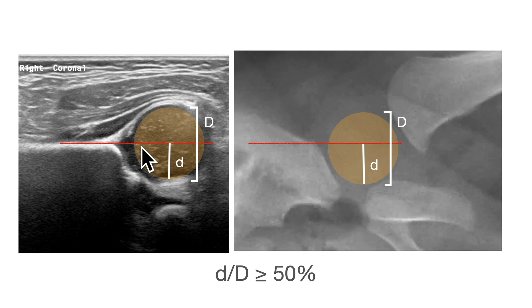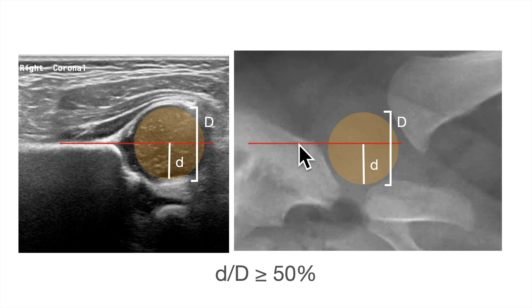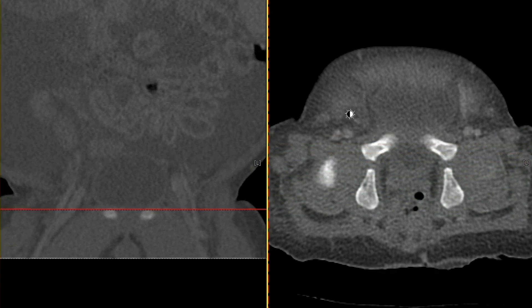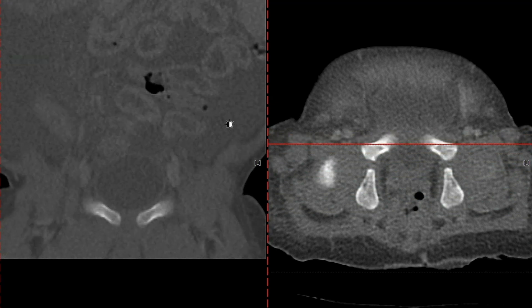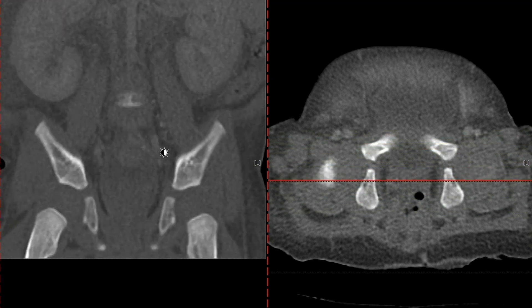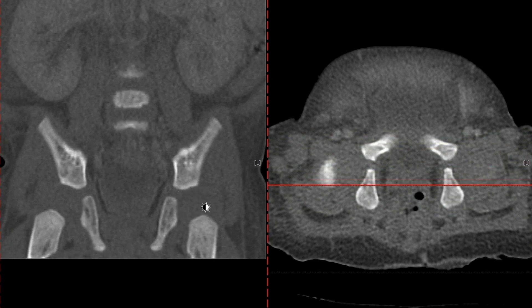Now let's take a look at that CT I promised you and see how the relationship of that iliac body with the acetabulum changes as we go from anterior to posterior — how it goes from a more supralateral and inframedial to a more vertical orientation. Here is a CT from a four-month-old. These are the coronal images on the left and the axial images on the right. As we go from front to back, we notice the iliac bone body is angled lateral-superior to medial-inferior. As we go further back, the shape of the iliac wing changes to a more vertical orientation, and by the time we're more posterior in the joint, the iliac body and wing are in fact a lot more vertical. This is around where we image with ultrasound.